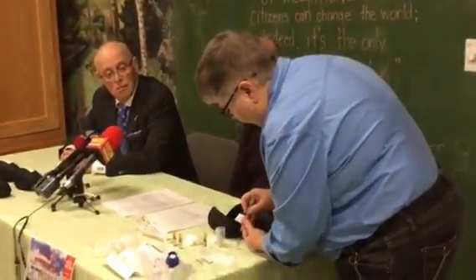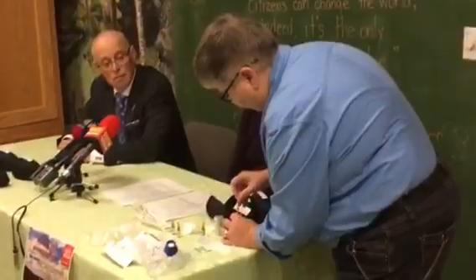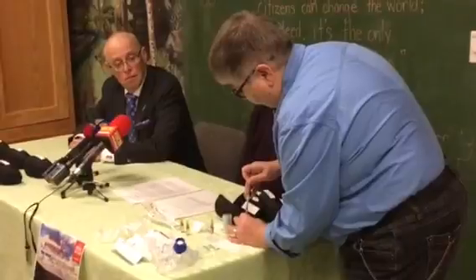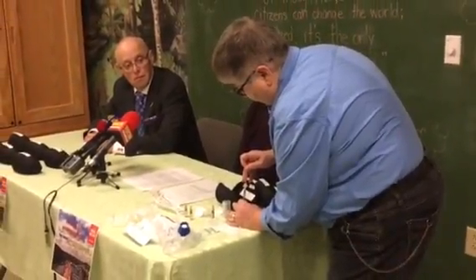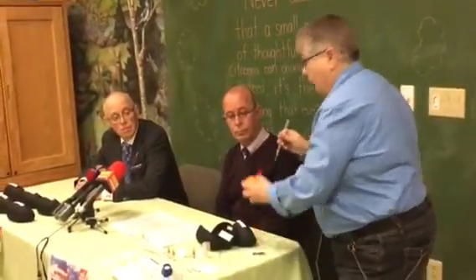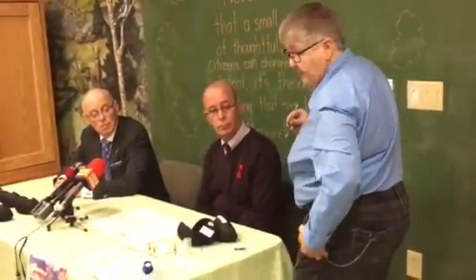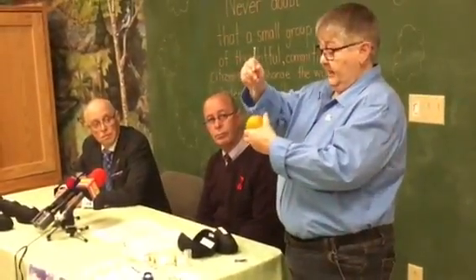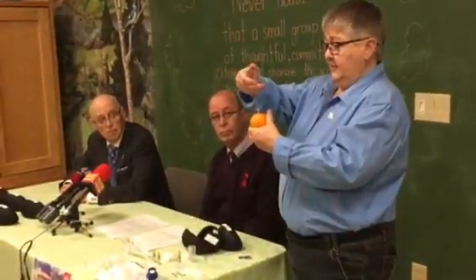snap it away from you, and take the syringe and draw up everything that's in the vial. Try not to touch the bottom of the vial. Just touching the bottom would probably dull the needle a bit. You don't have to worry about a lot of water, air in there because it's going into muscle. So right into the shoulder, the thigh, or the buttock is the best place, the nice big muscle, and you just stick it in at a 90-degree angle and then inject.